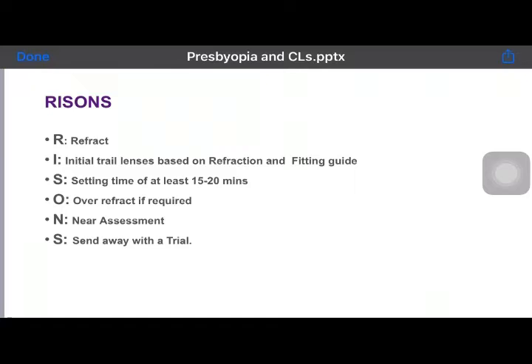Right, so that's a very good question actually. So yes, it should be well illuminated. The idea is, whenever you're checking for a multifocal, always do it in room illumination. That is the best option, and not in a dark room. So if you're checking the pupillary constriction, or how the pupil is reacting, whether the pupil is round, reacting, regular or not, do it in room illumination.